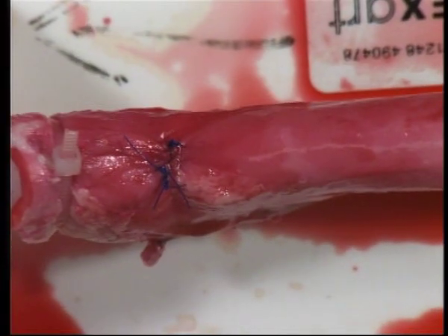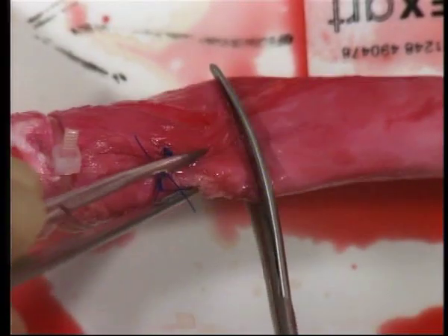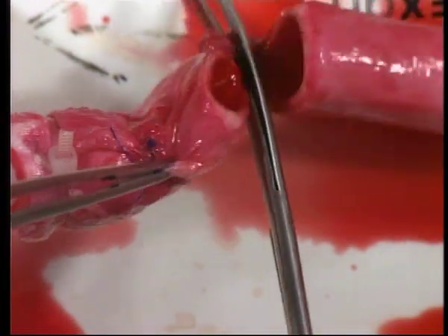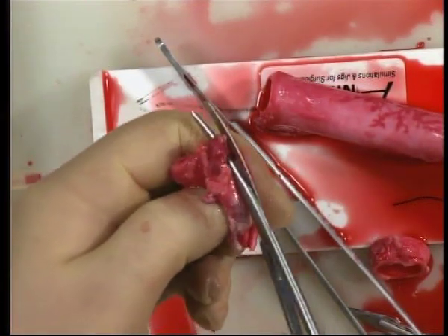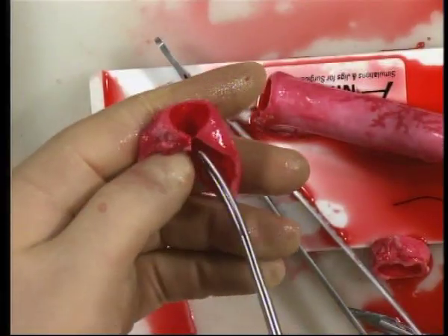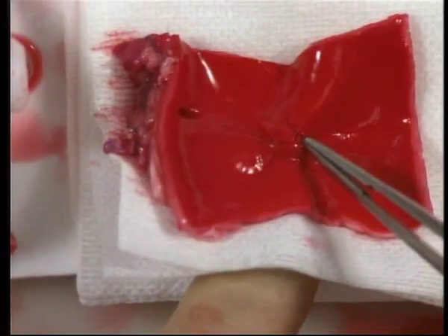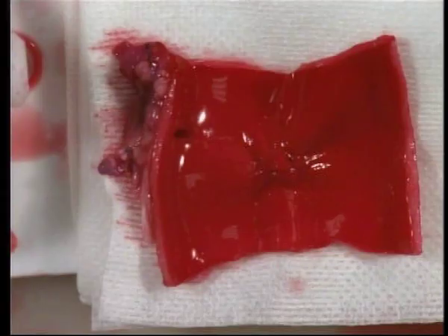You can check the inside of your aortotomy by dividing the aorta. First of all, remember to turn off the blood supply. You should see a nice smooth closure with no evidence of intimal flap.